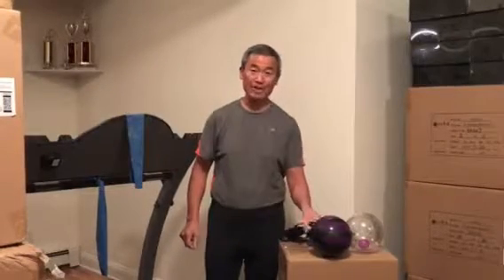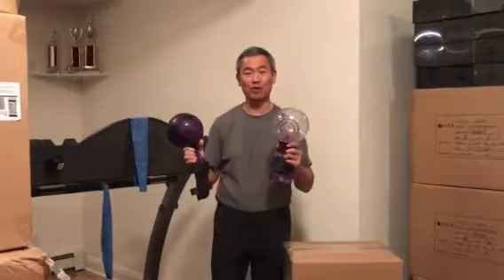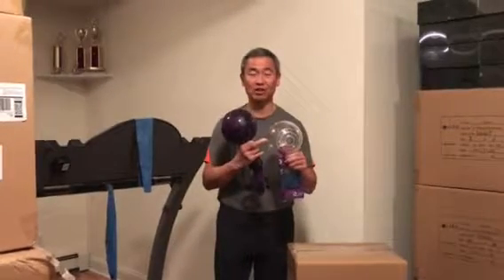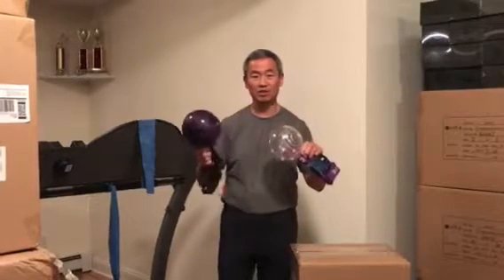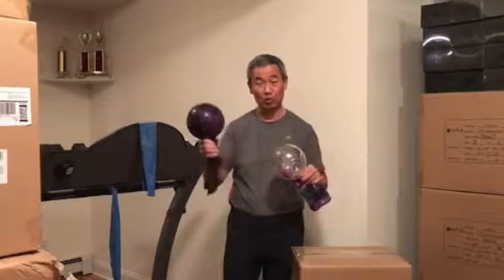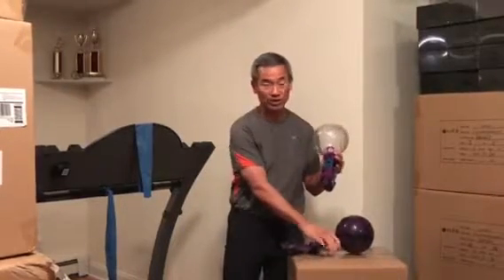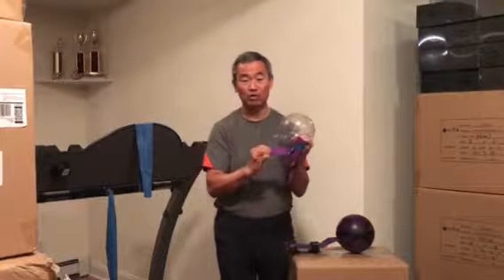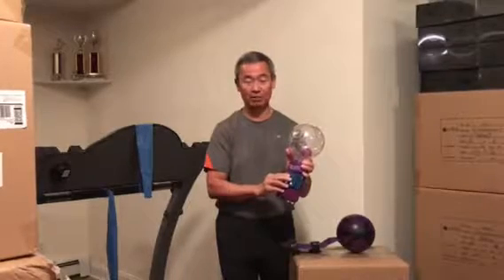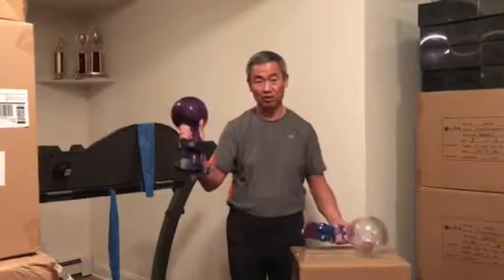Hello. When you get the ShoulderSphere, this is the prototype. This is the ShoulderSphere as we have it this time on Amazon. The only difference being that this is clear, you can see the ball rotate. This one is solid in color. You can only feel the ball rotate, but you don't see the ball rotate. But the rest of it is identical. The only other difference being that the new one has a Velcro attachment for you to put it on and has the electronic tracker. But for the investigation research, this is just good enough, no problem.